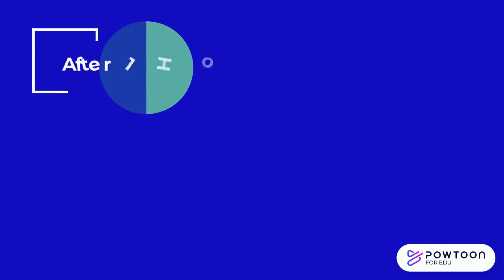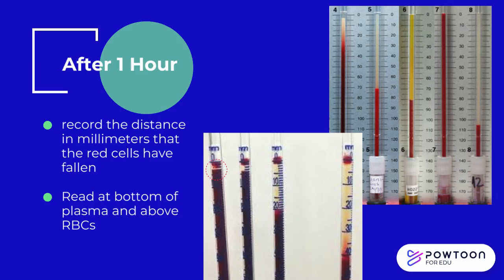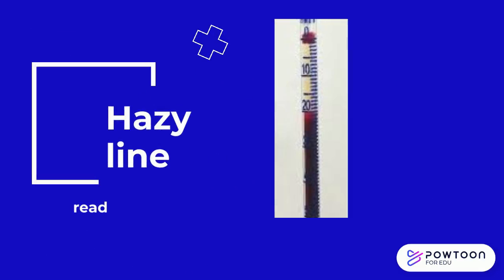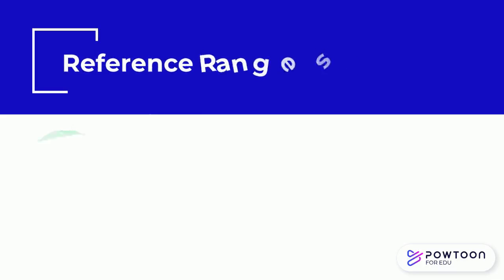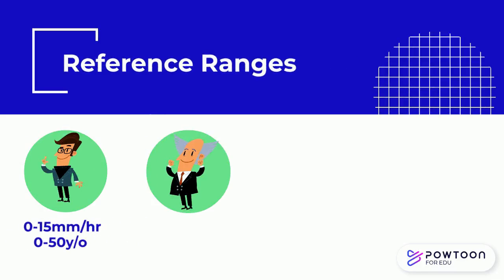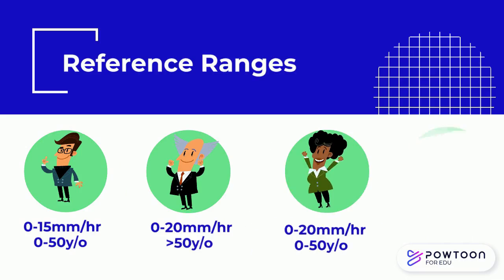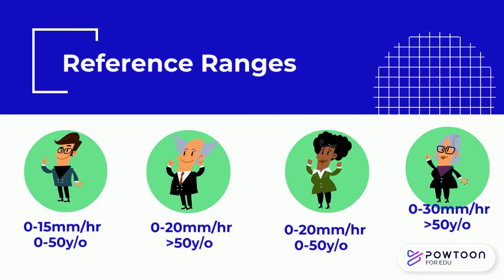At the end of 1 hour, record the distance in millimeters that the red cells have fallen. Read the tube from the bottom of the plasma meniscus to the top of the column of sedimented erythrocytes. Do not include the buffy coat in the reading — this reading is the ESR result in millimeters per hour. If the area of red blood cell-plasma separation is hazy, read the level where the full RBC density is apparent. Normal values using the Westergren method are 0–15 mm/hr for males aged 0–50, 0–20 mm/hr for females aged 0–50, and 0–30 mm/hr for those over 50 years old.